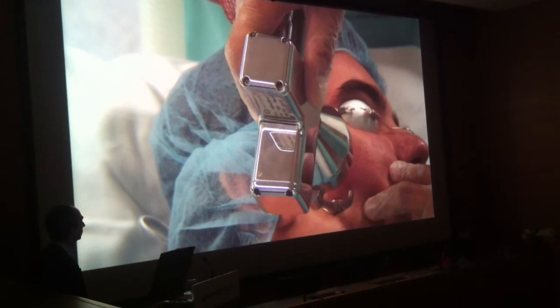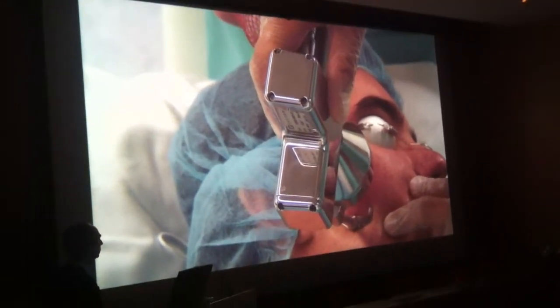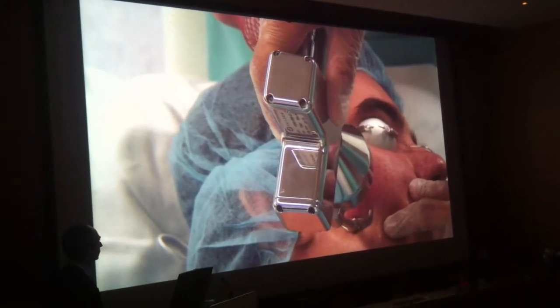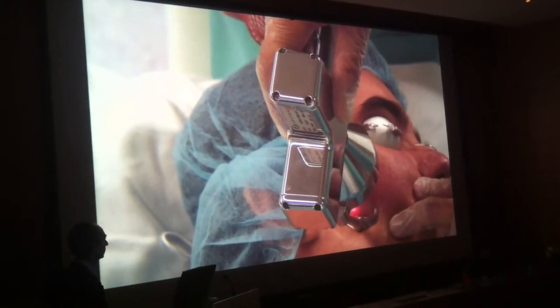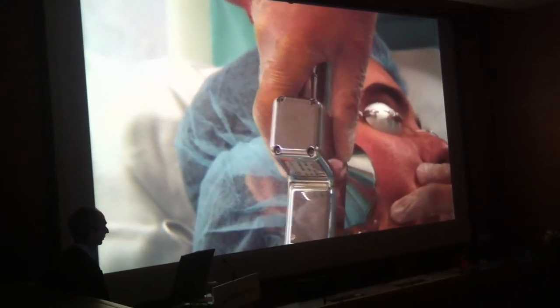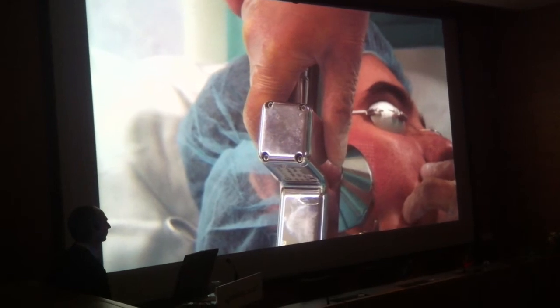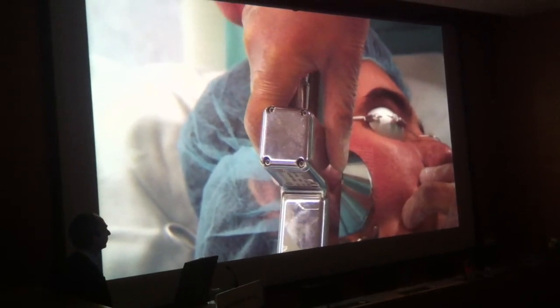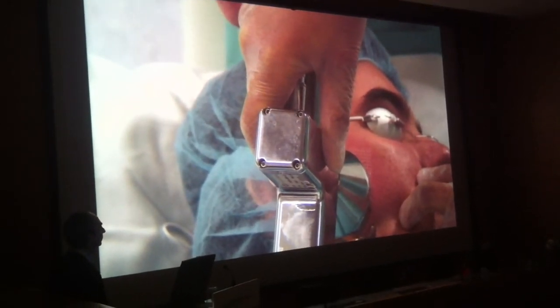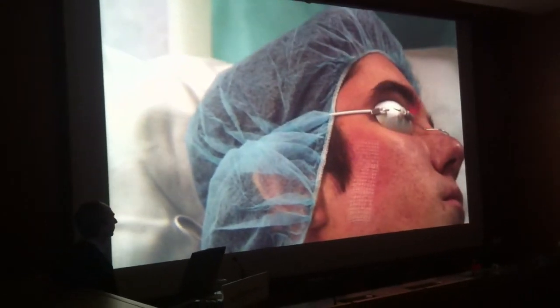So again, we don't need to be very aggressive in these cases. That's my opinion. Just in case you like to be aggressive, this laser is powerful enough to drill to the bone. There's no problem. I just wonder whether it's needed or not. I don't know. Probably the handpiece is on the way. I'm sorry. I'm going to change direction so you can see what I'm doing.